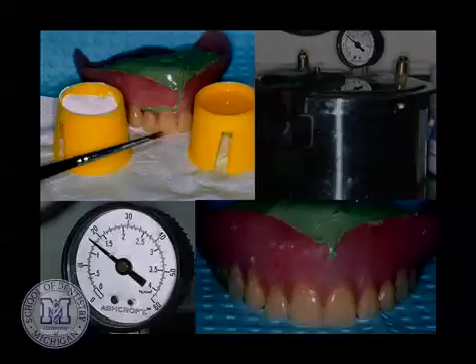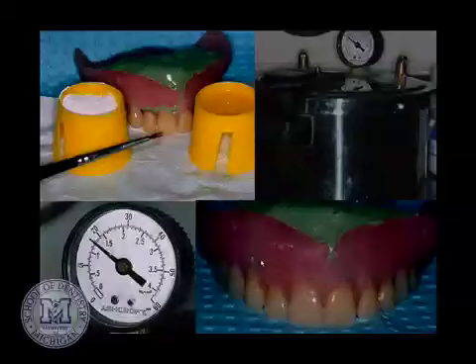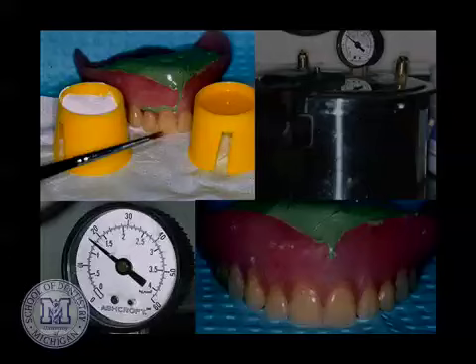Put the denture in the pressure pot—fill it about two-thirds full of hot water, place the repair in, and pump it up to about 20 PSI. This sets the acrylic so it's quite hard, resists stains, and is stronger. You may need to go back multiple times since the acrylic wants to slump: paint some on, pressure pot for three to five minutes, take it out, paint some more, repeat. There's your before with the crack and there's the repaired result.